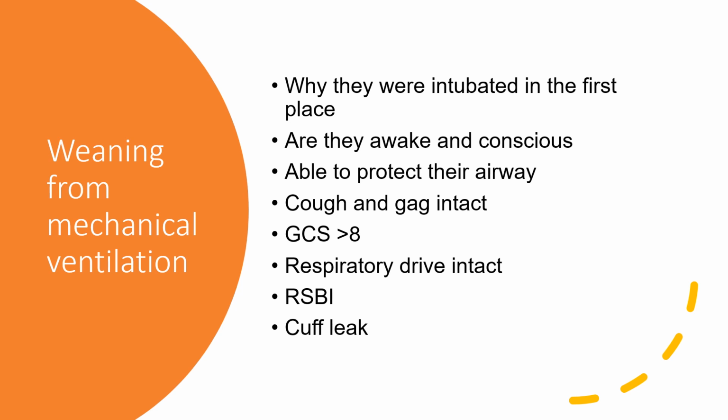Second thing you might want to look at is if they're awake and conscious. A lot of times people will tell you to pick your head up off the pillow. They could also say give you a thumbs up. There have been studies showing that patients with neuromuscular disease and certain patients with head injury do not really respond. So the point is, do we keep them intubated forever? But for the most part, if they are awake and conscious and they can put their thumbs up and they can lift their heads, this is a good sign.